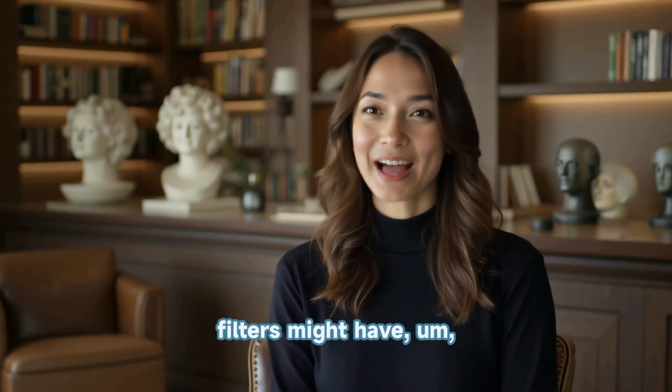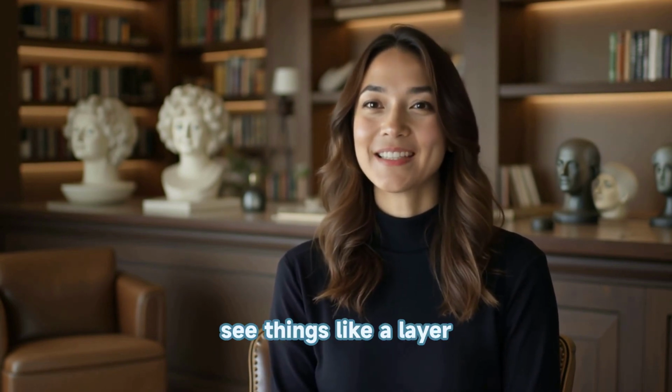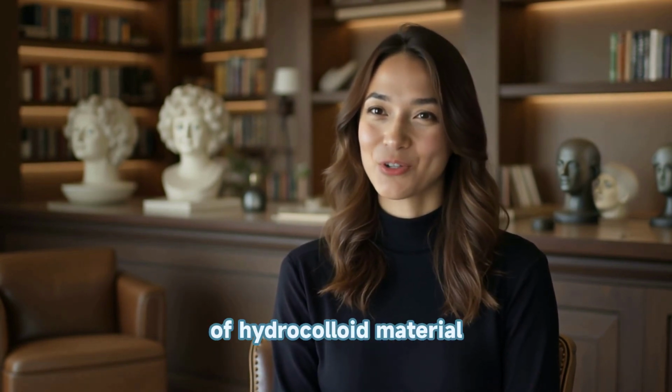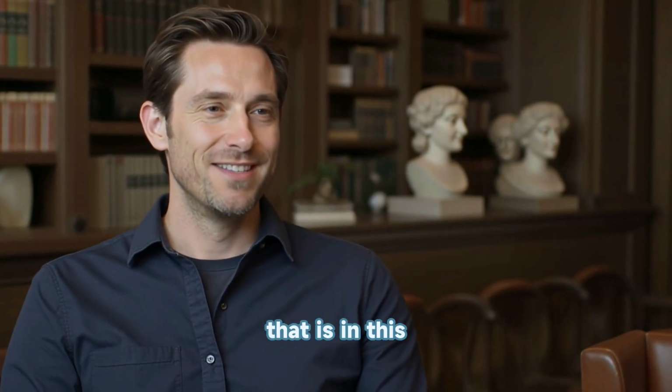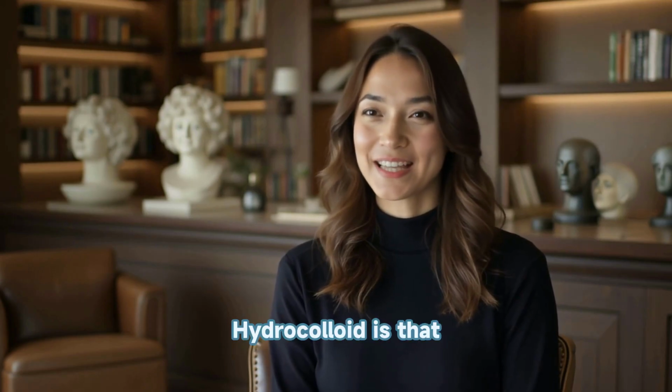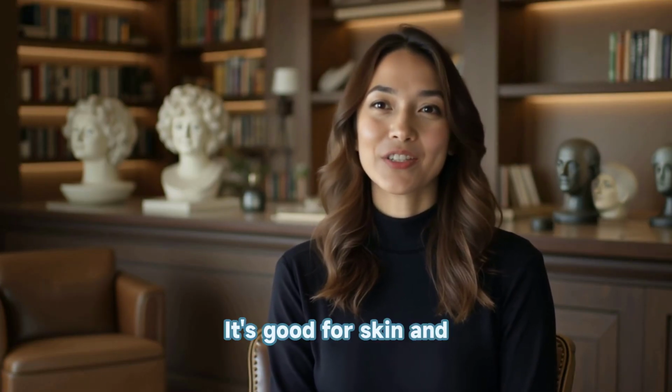Some filters might have extra built-in protection around them. You might see things like a layer of hydrocolloid material near the filter. Hang on. Hydrocolloid, can you just clarify what that is in this context? Sure. Hydrocolloid is that soft, sort of gel-like material you often find in the skin barrier part of the stoma bag. It's good for skin and it can handle a bit of moisture.